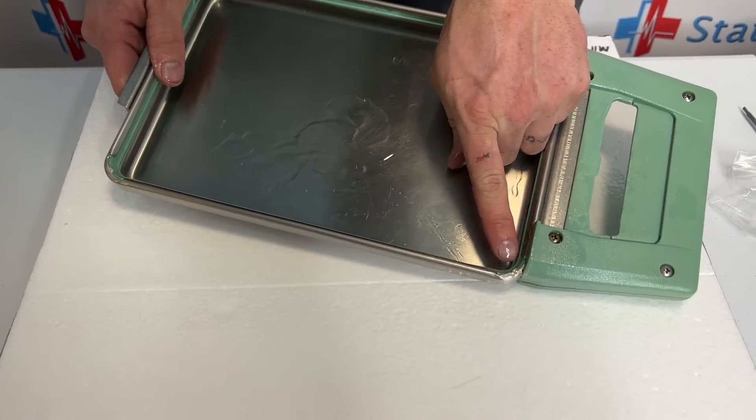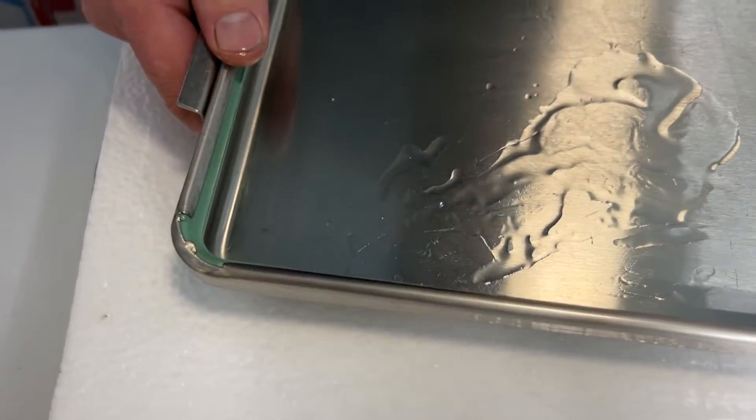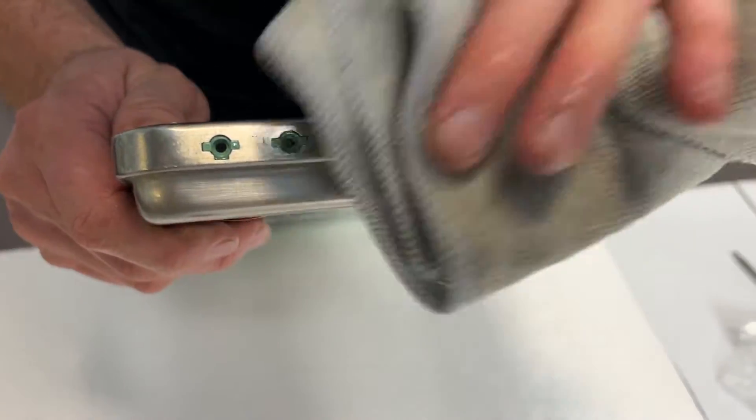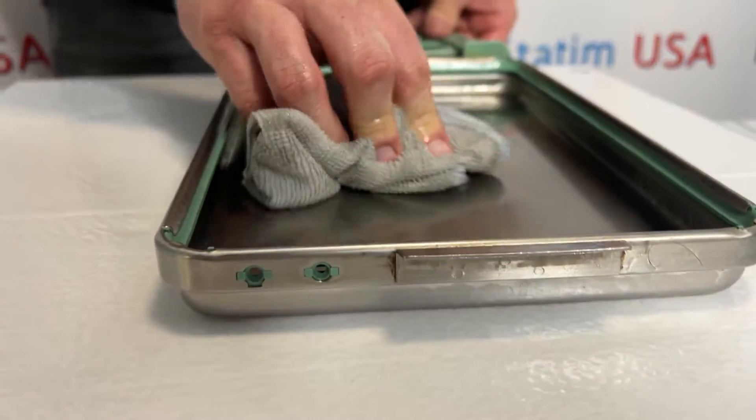When we're done, we want to inspect and make sure all the corners are lined up all the way around the seal. Make sure that the back is lined up. I'm going to wipe off the extra lubricant that's in there.